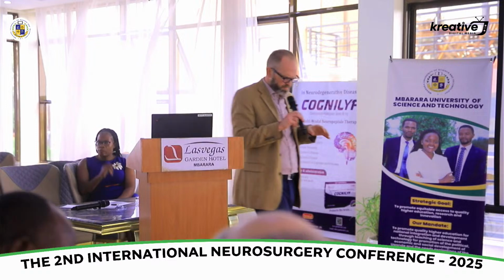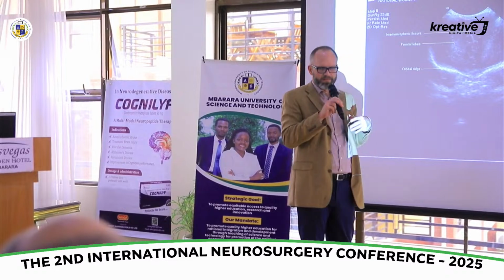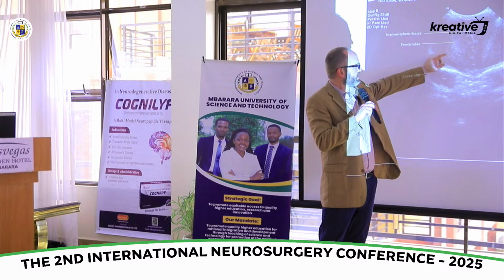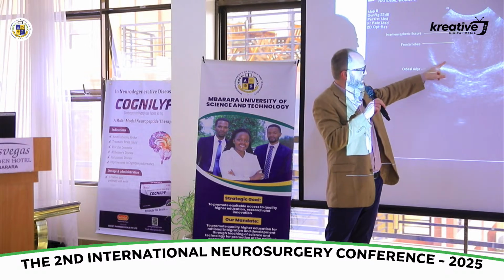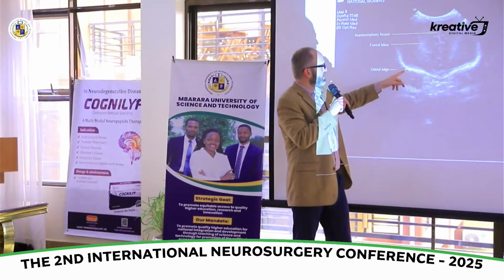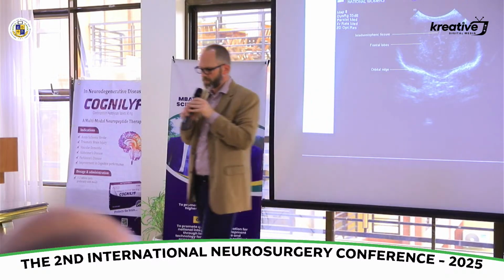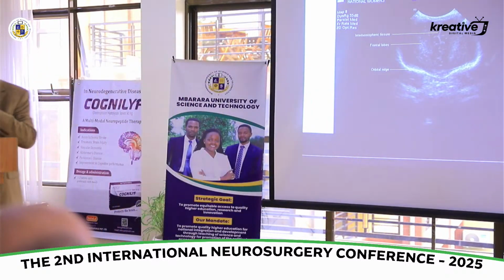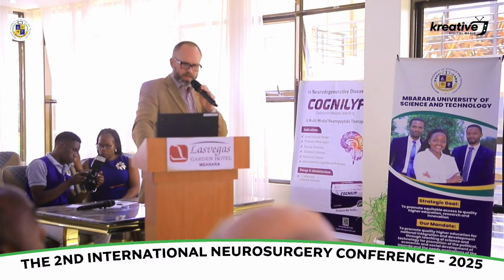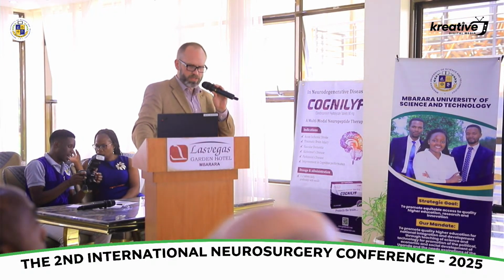So I'm not going to belabor this too much, but just understanding that as myelin forms, right, the older the brain, the more distinct it's going to look. Here you get the interhemispheric fissure. This is still not as well myelinated as it gets later in life, but as you come back, you can see this is through the skin. So the brain images are much more distinct, and we'll show some of those later.